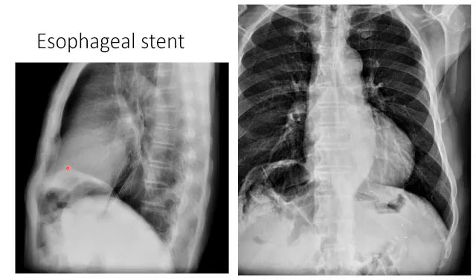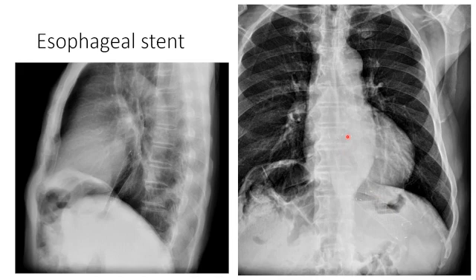You may also see esophageal stents. This one is in the distal esophagus heading across the gastroesophageal junction. These are typically placed in esophageal cancer patients to provide symptomatic relief from esophageal strictures and dysphagia.